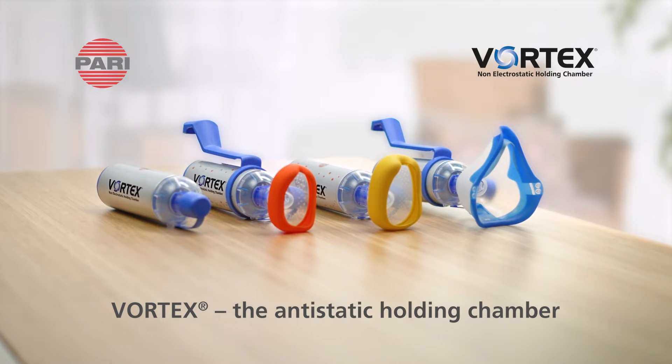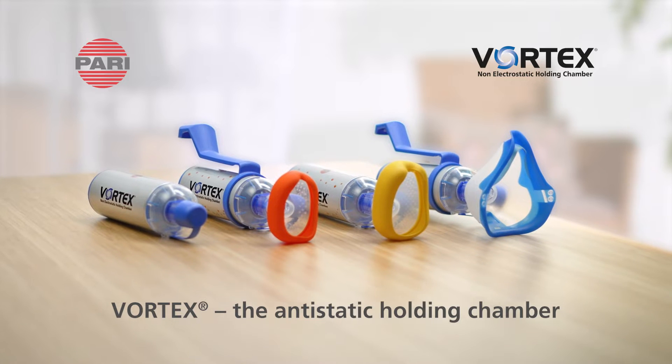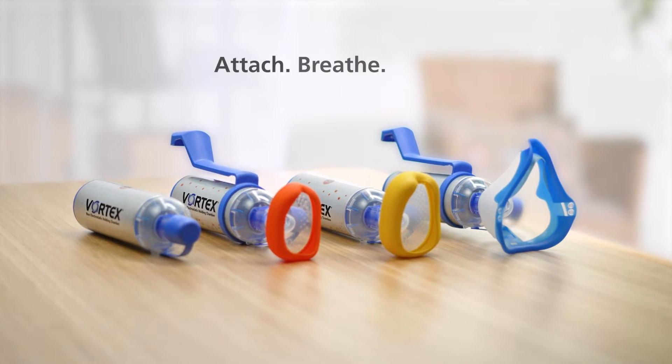Vortex, the anti-static holding chamber, so that the active substance reaches where it's needed.